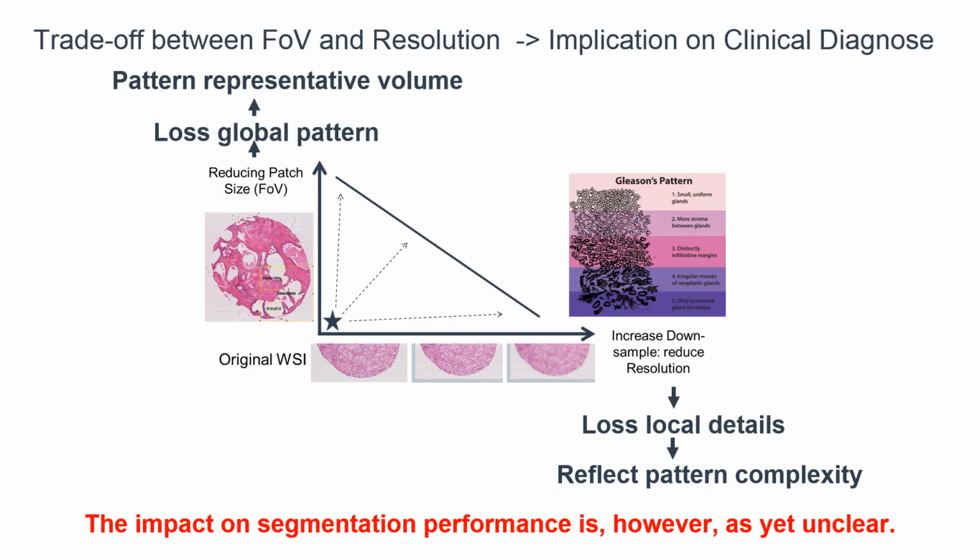Clinically, the trade-off would mean that when reducing the patch size, one would lose global pattern. However, when reducing the resolution, one would lose local details. Such configuration is usually based on empirical experiments. However, the impact on segmentation performance is as yet unclear.